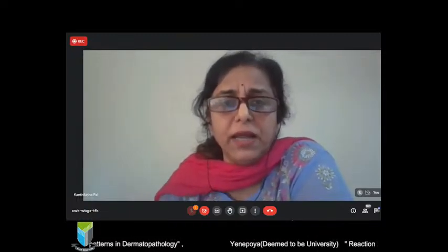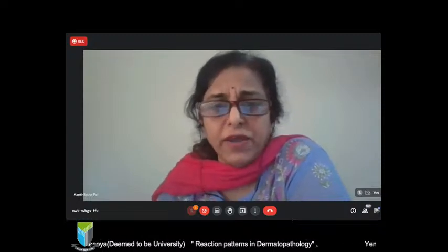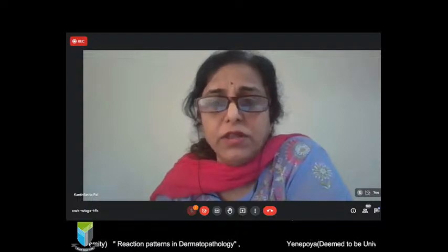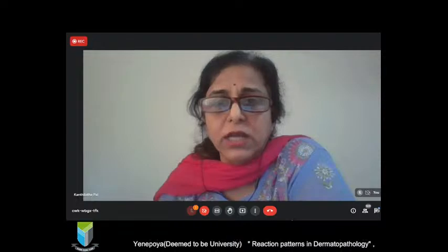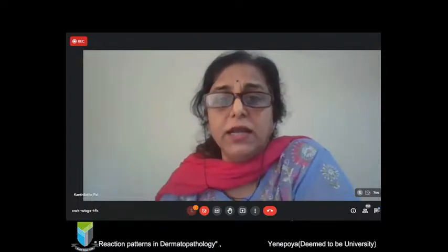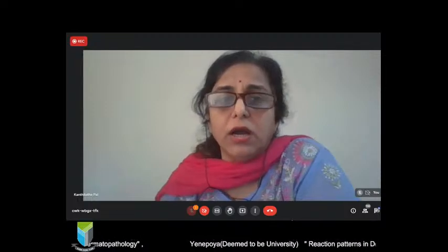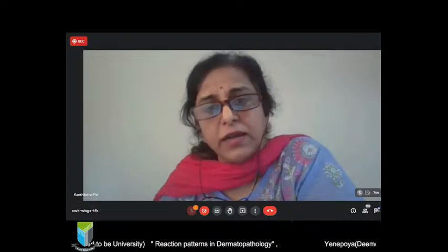So if you look at the biopsy forms, the dermatologist would give you a lot of diagnoses like atopic dermatitis, allergic contact dermatitis, irritant dermatitis. There may be varied names that they give based on the clinical findings. But for us, for pathologists, they all have the similar picture that I just described. Histologically, we cannot really distinguish atopic dermatitis or nummular dermatitis or any of these other kinds of dermatitis.